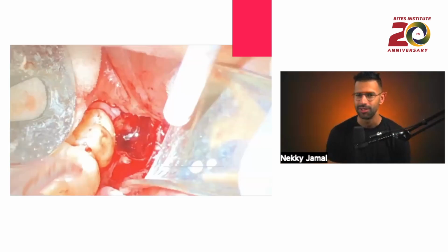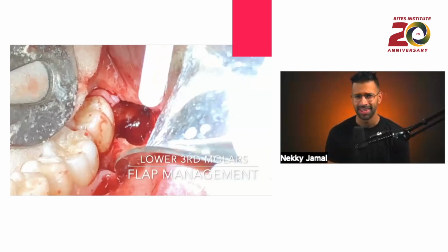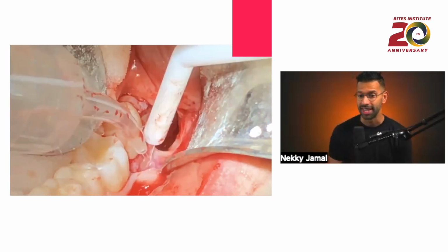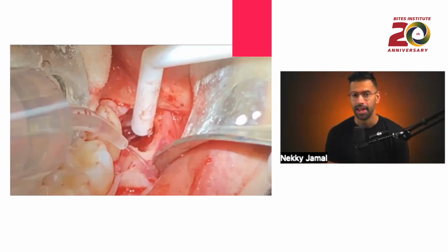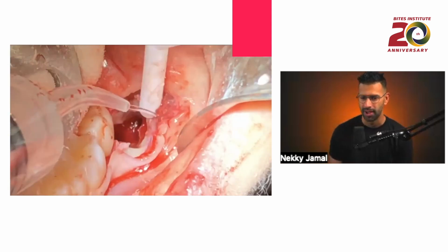After you take out that tooth, rinse that site. Make sure that there's no bone chips or anything in there. Make sure all the roots are out of there. Okay, we don't want to aggressively irrigate that site. I'll show you exactly how I'm irrigating my site here. I'm just using saline. I want to make sure that there's no tooth or bone chips on that periosteum.